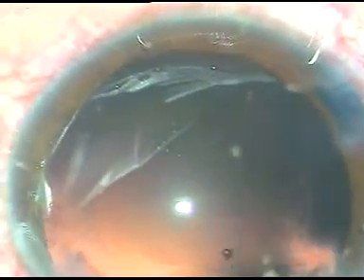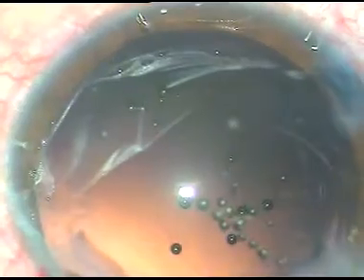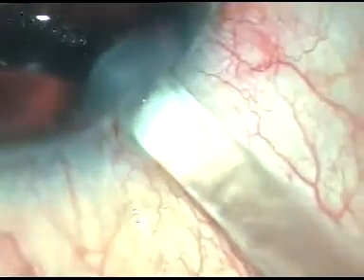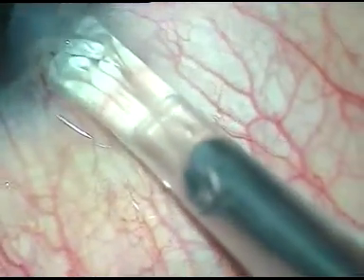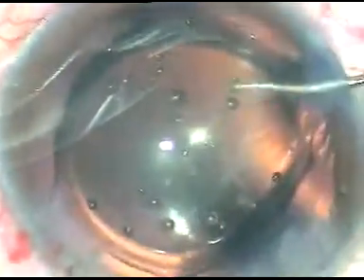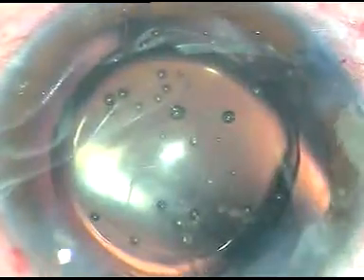2% HPMC is again injected and a hydrophobic acrylic aspheric intraocular lens is implanted inside the capsular bag. A Sinskey hook is used to dial the intraocular lens and place it at a desired position.